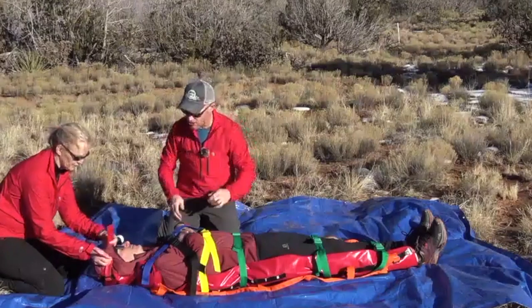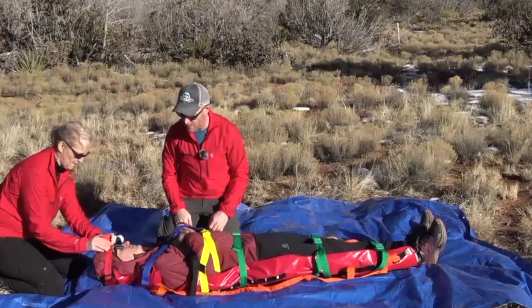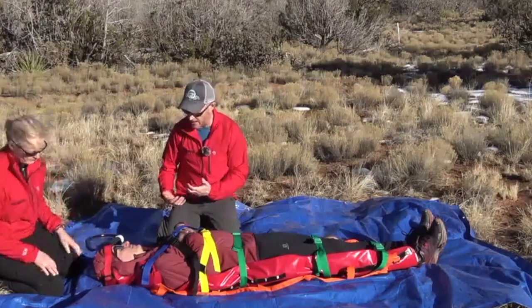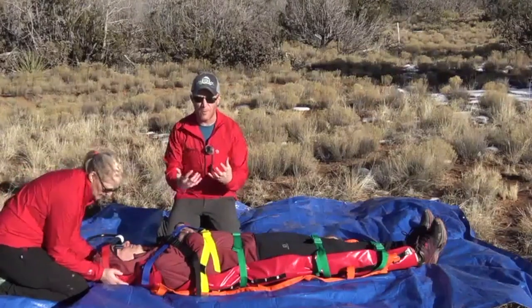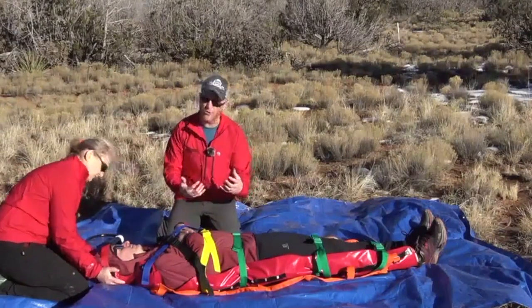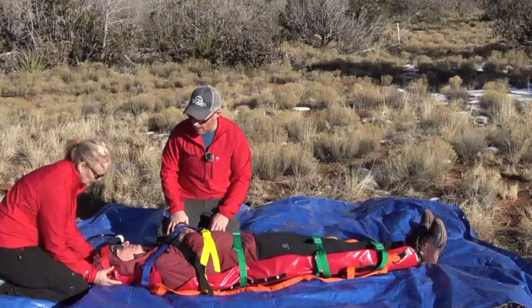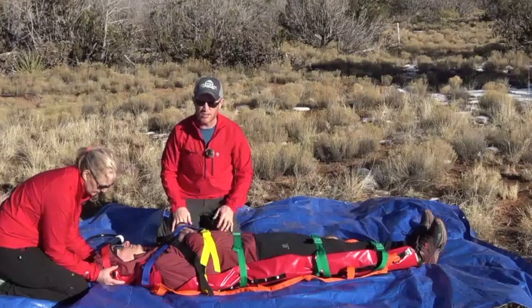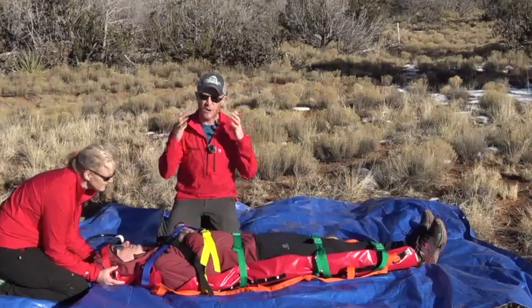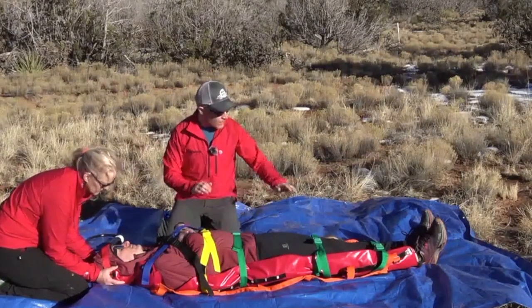Janet's going to go ahead and attach our head strap. Particularly if we're concerned about some type of head or neck injury, it's important to stabilize and mold the mattress while we're deploying the vacuum to make sure it conforms well and gives good stability and spinal motion restriction around the head and the neck.